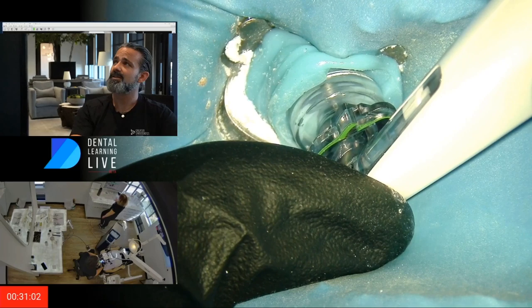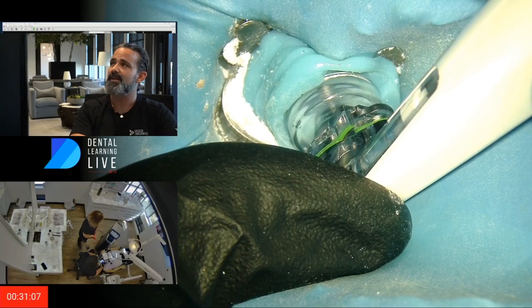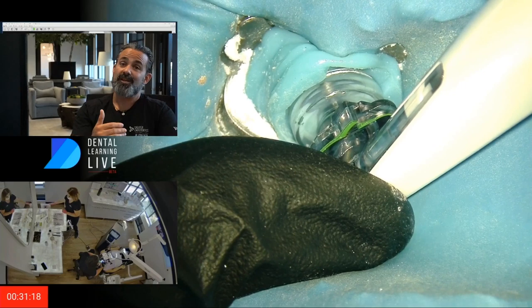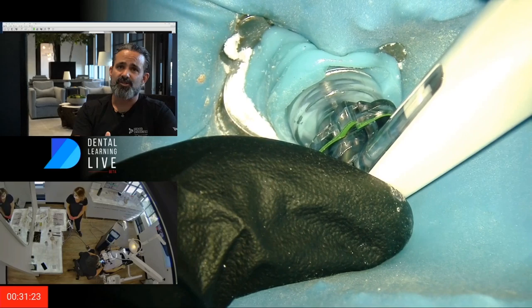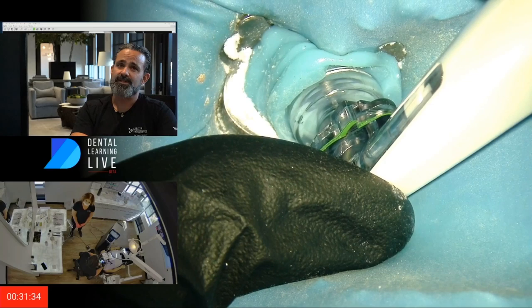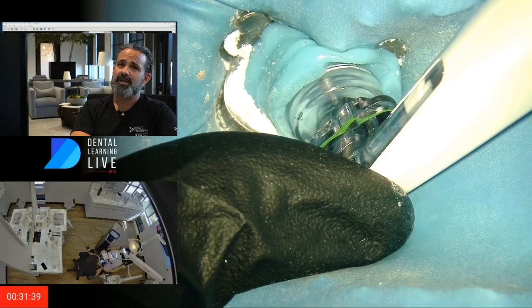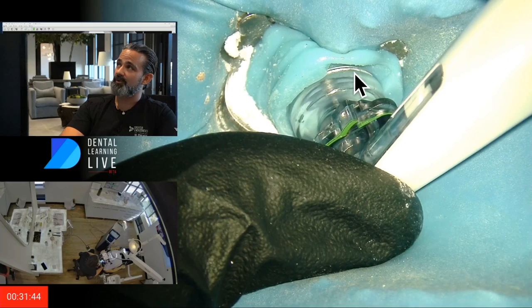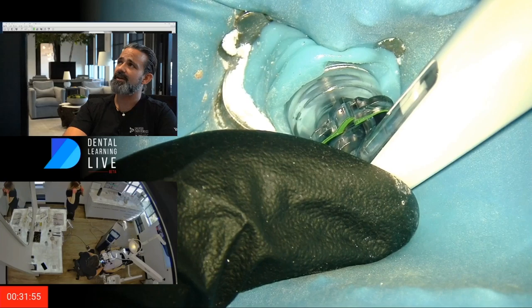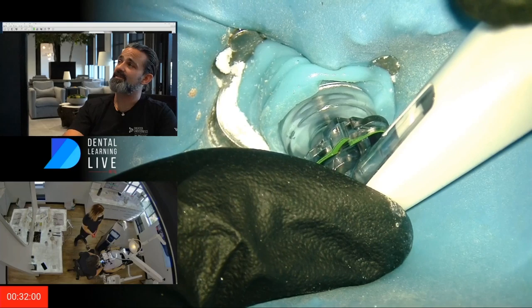They do give us the option to advance. Why would you want that? What if there's a resorption defect that was undiagnosed, or an instrumentation error, or it was just too efficient and you start noticing contents or separations coming through the end? You might want to advance if you start seeing things — that's a clinical judgment, and the timing of that comes by experience. That's why you're a doctor. In vital cases I can always go back and recheck my work with a file and see if there's any tissue tags in there. We still have the way we've been doing it — always trust, but always verify your findings.